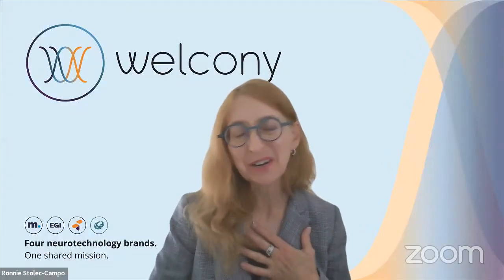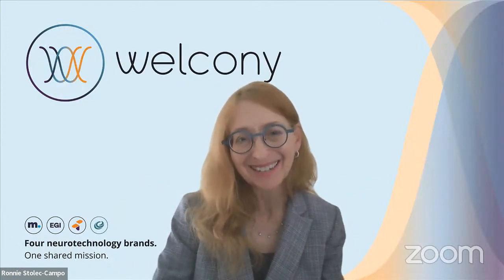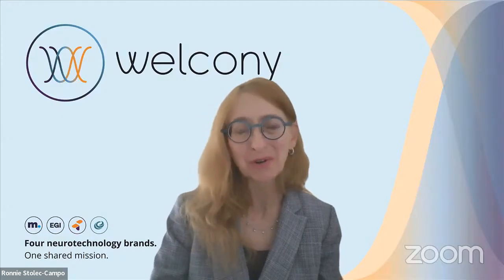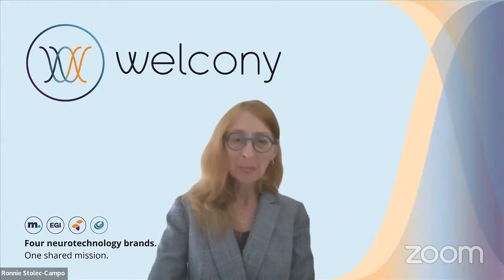Joe, as a bioengineer, I'm always so excited to talk about coil decay. Do you want to just address our coil decay testing and how our coils work? Great question. I did some of this testing when I was engineering back in the UK.